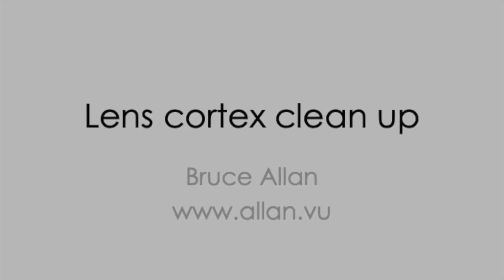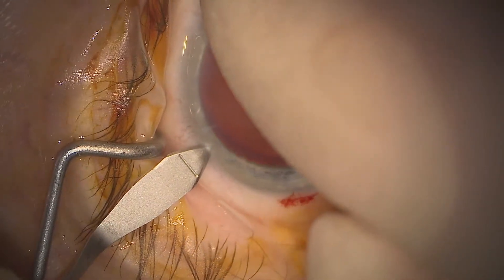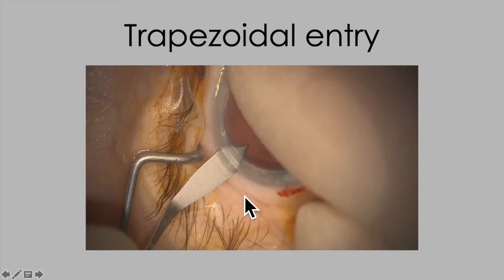In this video we're going to look at a few pointers on lens cortex cleanup, but before we do we're going to say a word on entry site construction. Have a look here — you can see that we're making the paracentesis a little bit generous, and we're also using a keratome here to make the side ports.